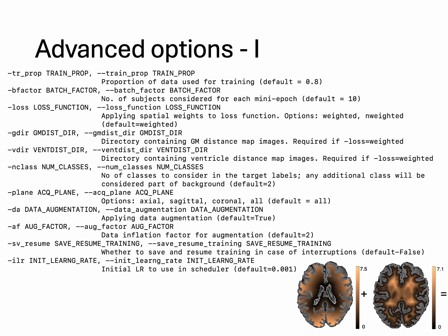So you will use a learning rate to train a model, and the learning rate will be subsequently reduced using a scheduler, but this is essentially what you would specify as an initial learning rate for training the model. The default option is 10 power minus 3, so you can change it slightly, but you have to handle this with caution. You cannot go too low or too high.